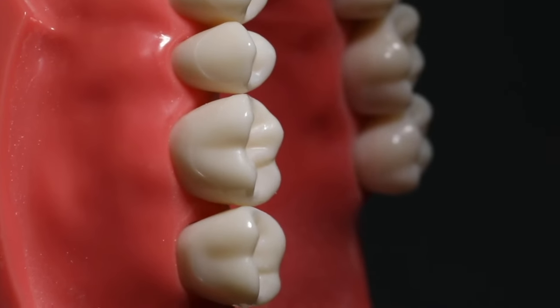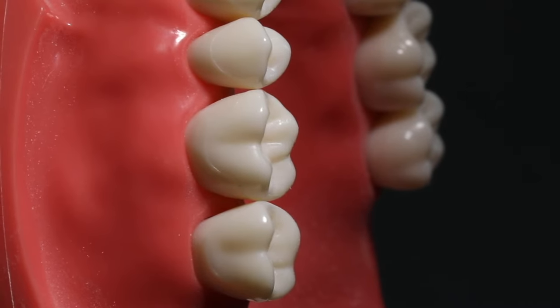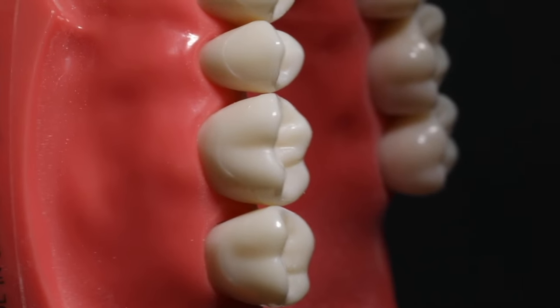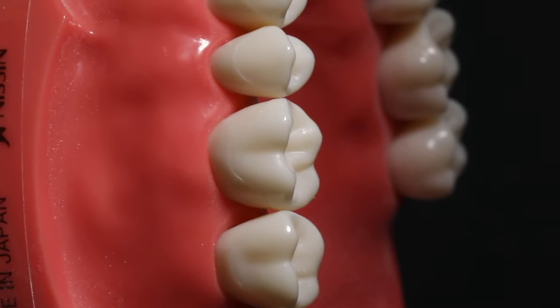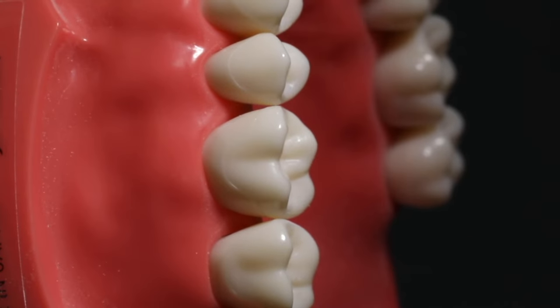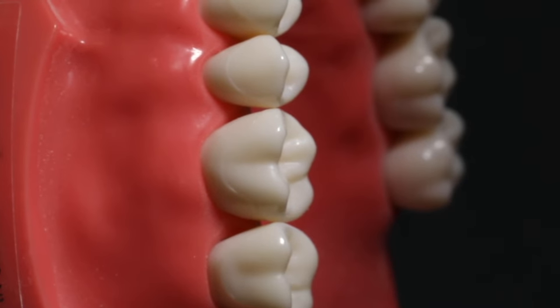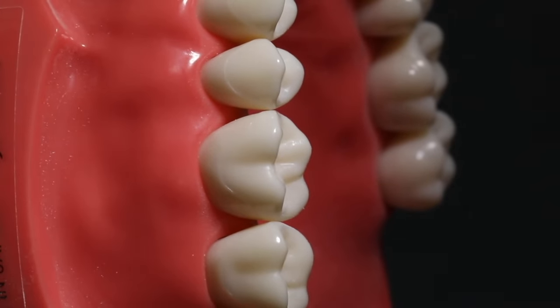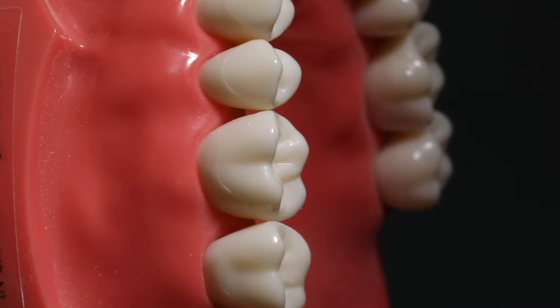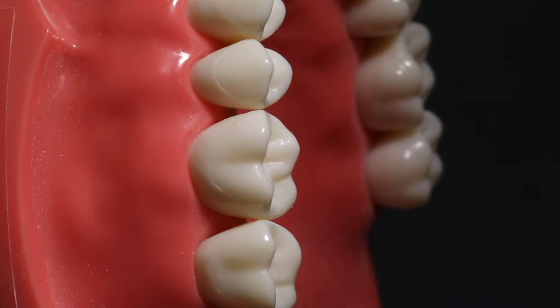Okay, we are now going to do a full zirconia crown preparation for tooth number 3. We're going to change things a little bit on this preparation. Rather than doing our proximal surfaces and breaking contact first, we're going to do our occlusal reduction first and then break proximal contact. The other thing we're going to change is rather than creating a chamfer margin, we're going to do a rounded shoulder.